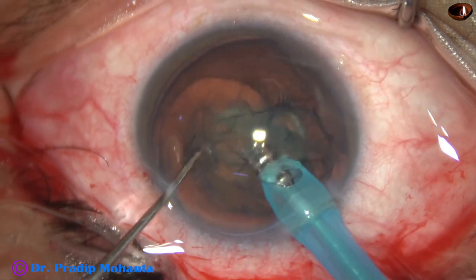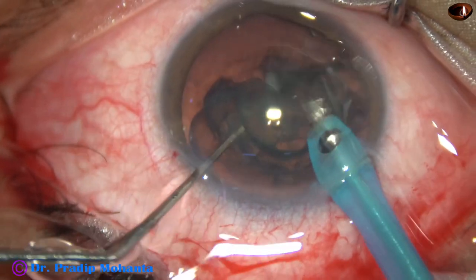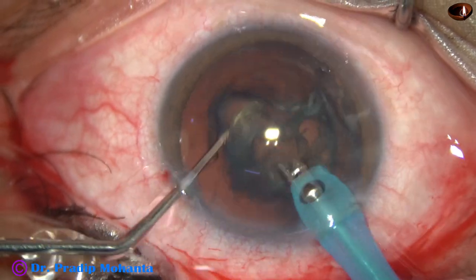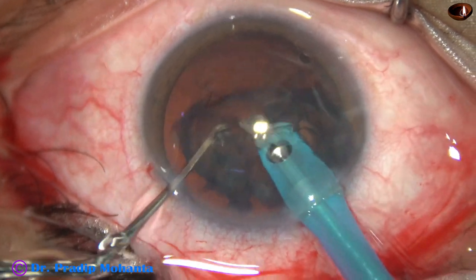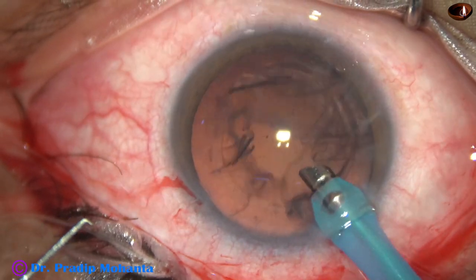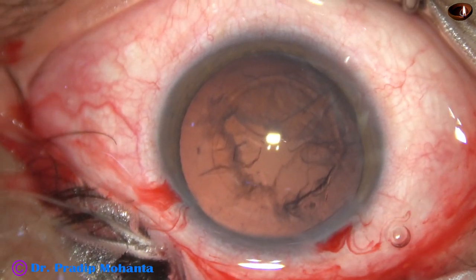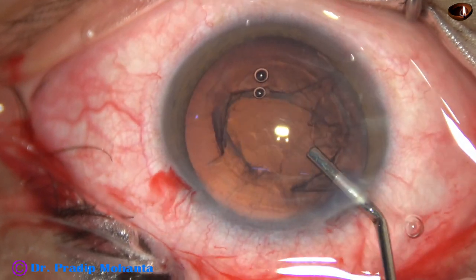Now vacuum is applied with the FACO handpiece, and a little bit of ultrasonic energy is applied in between. The whole mass comes to the aspirating port of the FACO handpiece. Remove the chopper so that flexibility is increased, and it is done — the whole lens mass has come out.